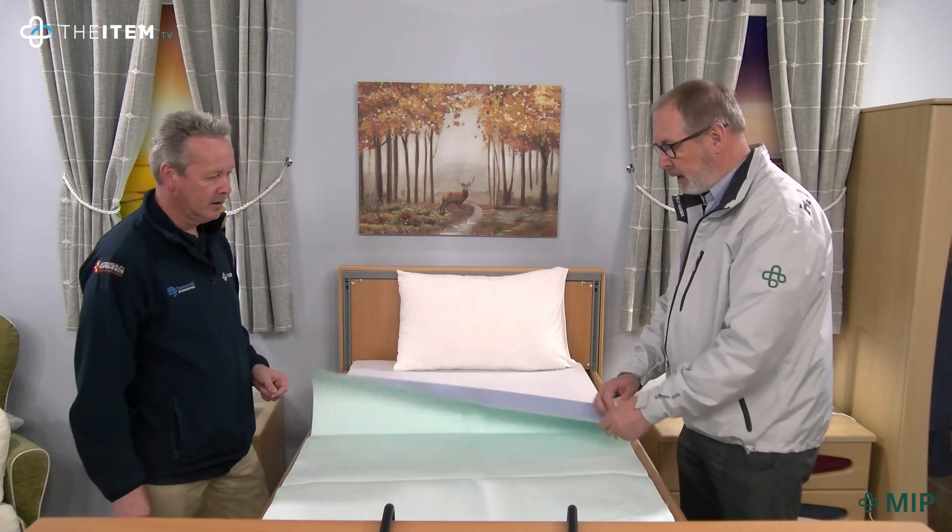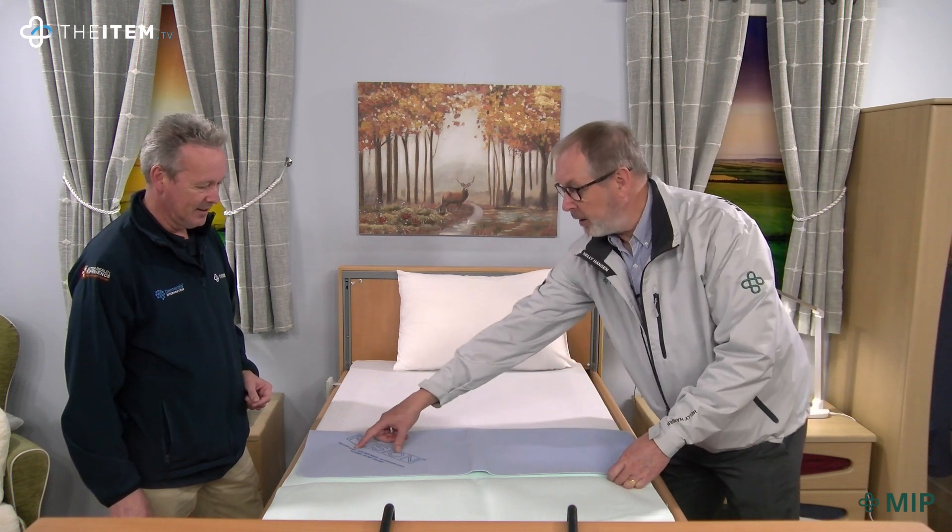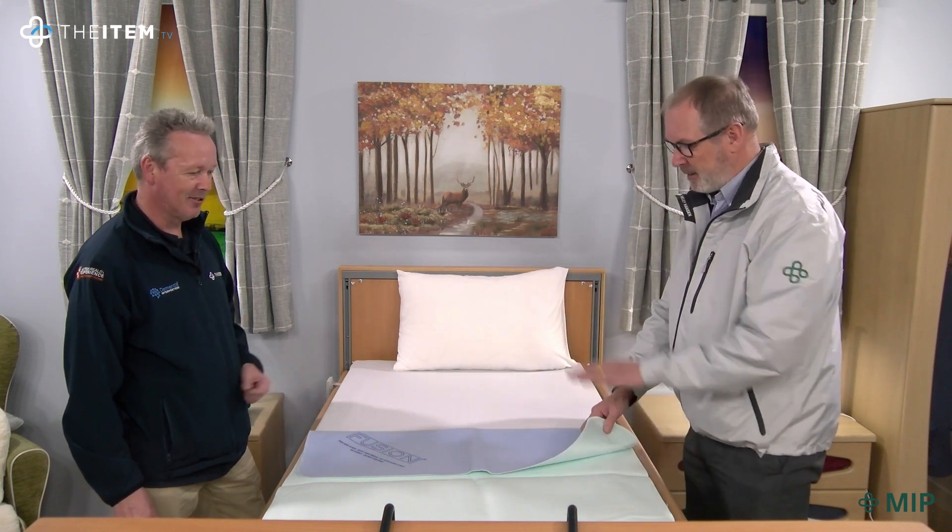The backing layer is always the barrier layer, so it is water resistant. You can't get confused about which way to put it down, because it actually tells you 'this side down' where the logo is. Easy instructions.